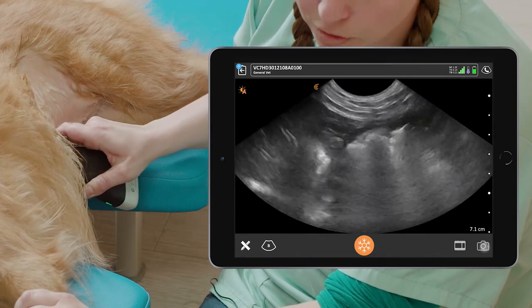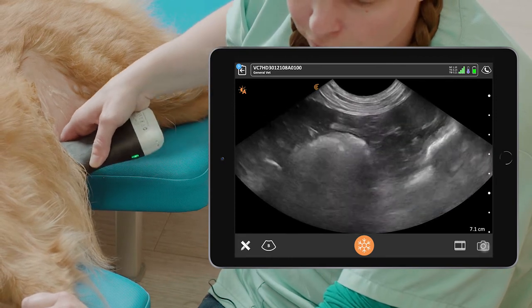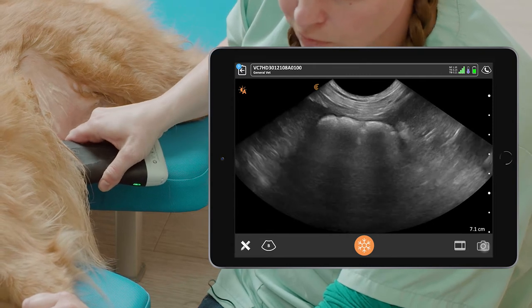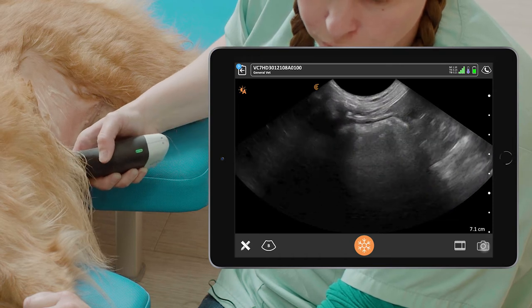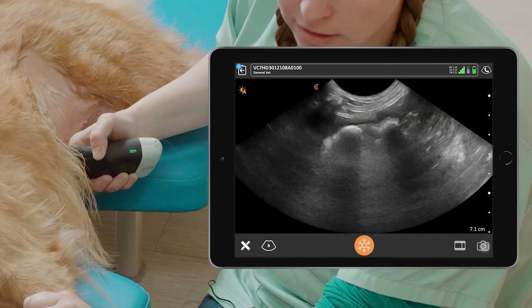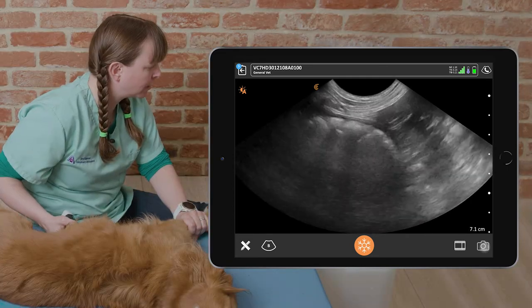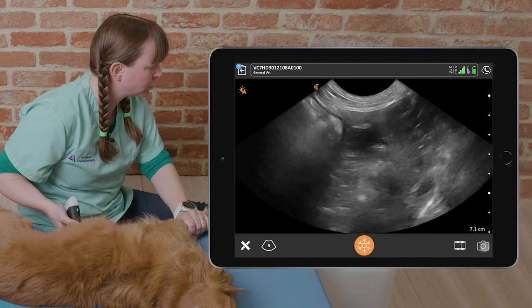We fan upwards towards the fundus underneath the rib cage and then fan ventrally towards the pylorus. We've viewed the stomach in one plane, and then we can rotate the probe to get a more longitudinal view, rocking underneath the rib cage to get a view of the fundus, and then rocking ventrally to get a view down towards the pylorus.